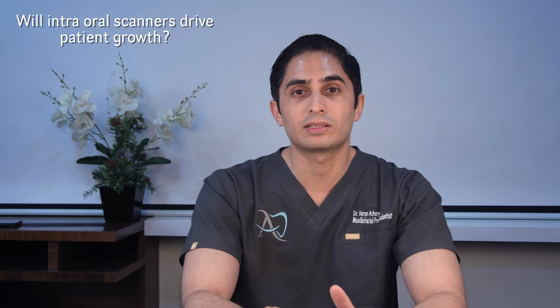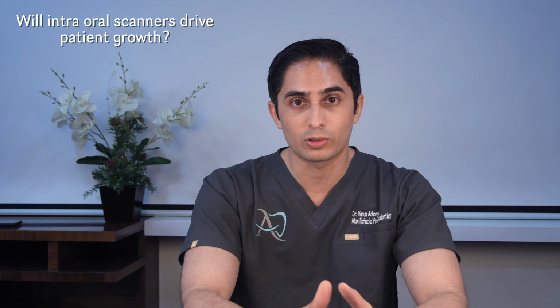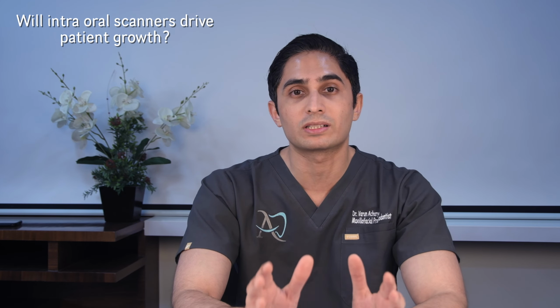They are most interested in getting comfortable restoration. They are not really interested in whatever technology you've invested unless it helps them get that comfortable restoration. So again, it goes back to you need to improve your skills first and then look at getting the intraoral scanner. So if your horizon is to, let's say, buy that scanner soon, maybe spend the next 6 months or the next year developing your skills to get perfect analog impressions first and getting perfect crowns out of your lab, and then look at the intraoral scanner.